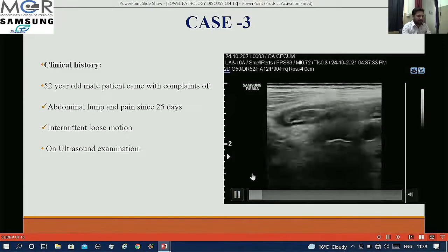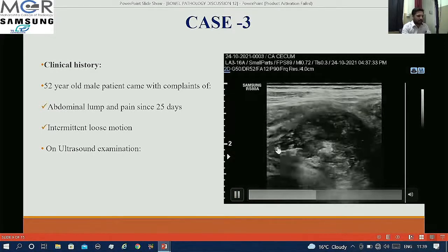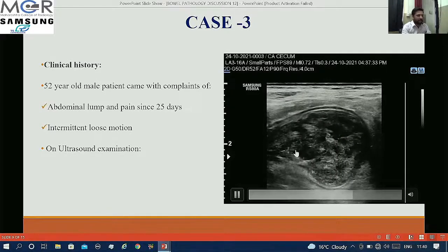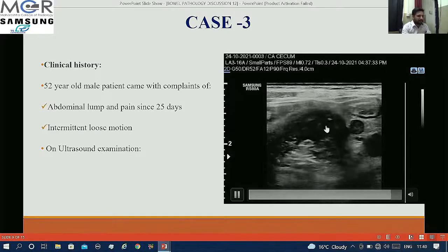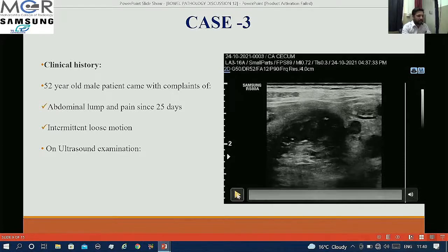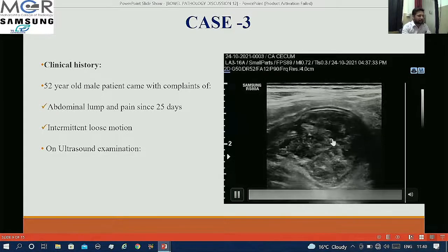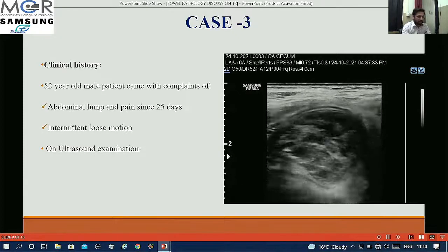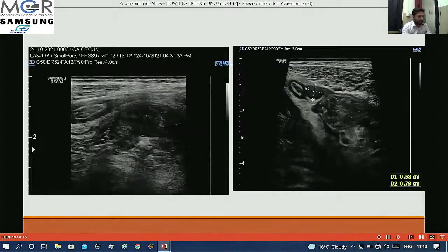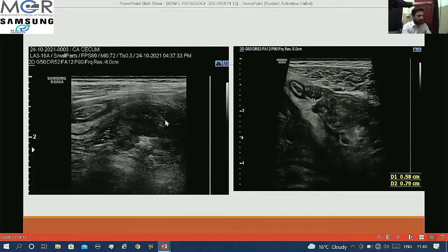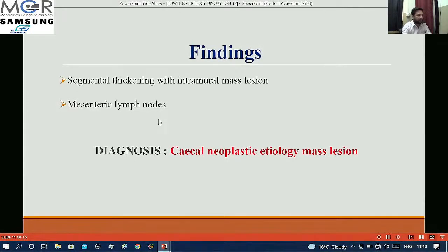We can see here the appendix. In the cecum we can clearly see there is intramural thickening with a hypoechoic mass lesion within. The patient was also having few lymph nodes. So my findings were segmental thickening with intramural mass lesion with mesenteric lymph nodes, and my diagnosis was cecal neoplastic etiology — a mass lesion.